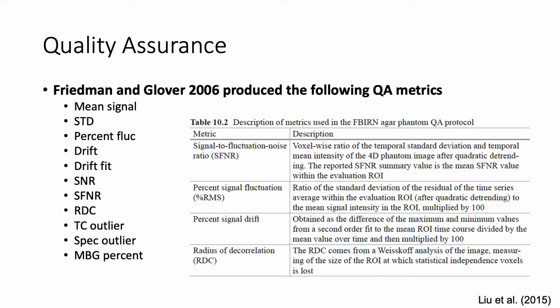Is there any relationship between, let's say your subcortical structure, take the hippocampus, the smaller the region is, is there any relationship with the drift of the signal? I guess I'm not 100% sure. I know there's different tissues that, in the temporal lobe, can be susceptible to some of these artifacts, and so there might be more drift, but I haven't really looked into it in detail.